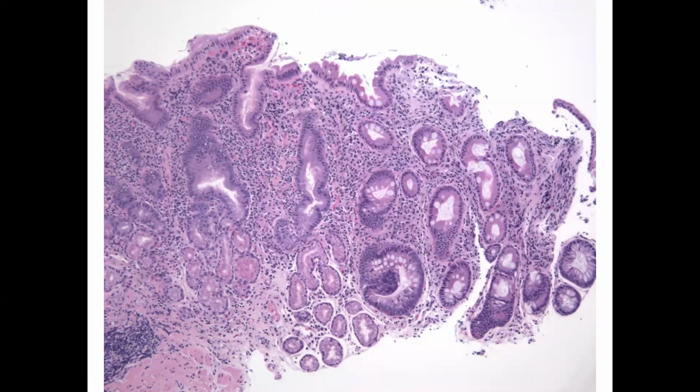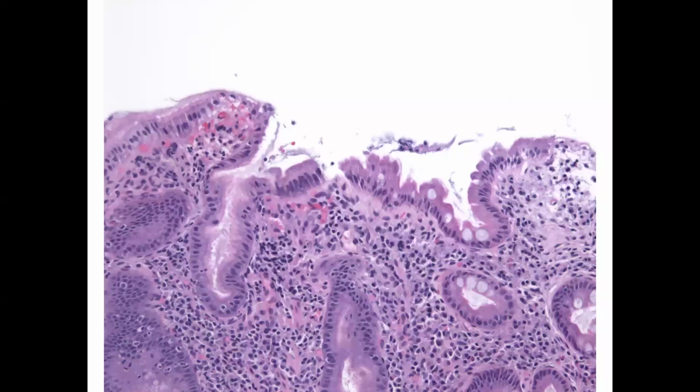Here's another case of chronic gastritis, and it looks like there's probably some activity. I think there's maybe a few neutrophils there. It's a little hard to tell, but in any case, it's clearly chronic gastritis. And on the right side here, you see those same goblet cells that we had seen in the GE junction here. And so chronic injury from chronic gastritis can end up resulting in intestinal metaplasia and atrophic gastritis. Here's an image at higher power showing again the difference between the gastric foveolar type epithelium and then the presence of these really large bluish mucin vacuoles indicating intestinal metaplasia.